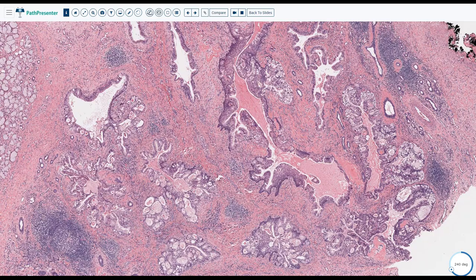Anybody know what are the poor prognostic features, that if we have them, this is not good? First of all, besides the cystic component, is the mitosis. So we have to look for mitosis, and solid areas as well. And mitosis, it is more than, anybody know how many? Yes, excellent.